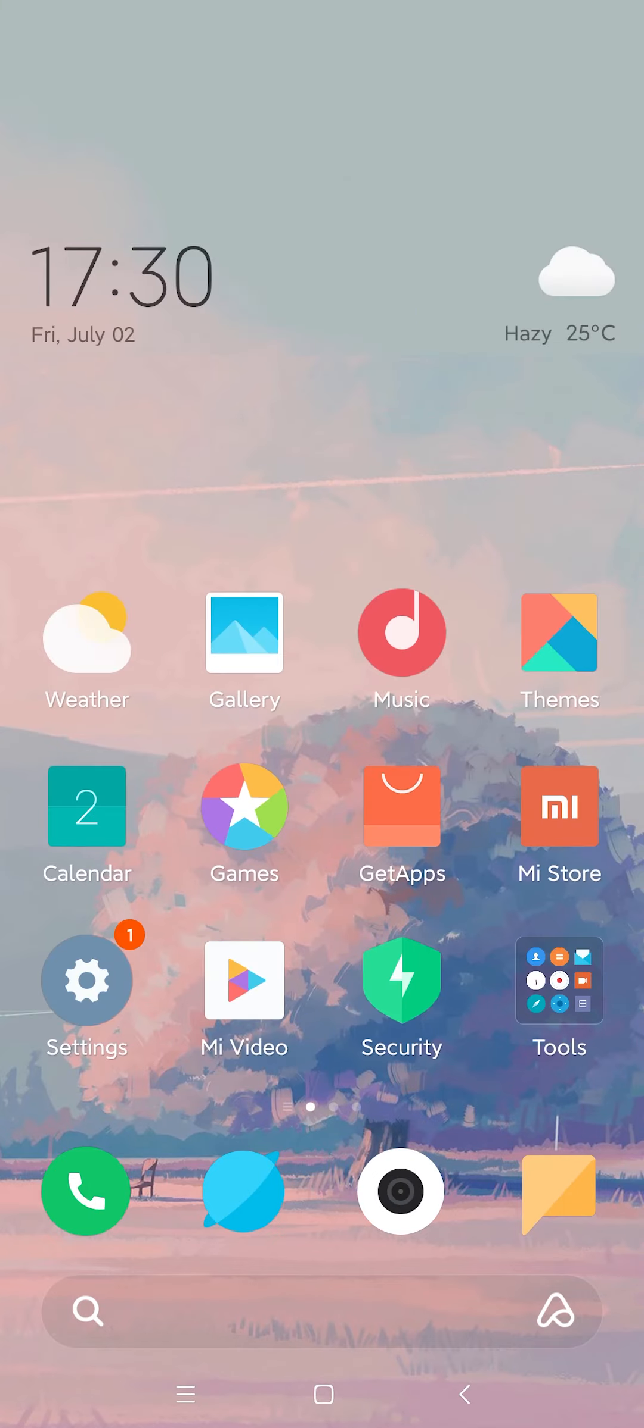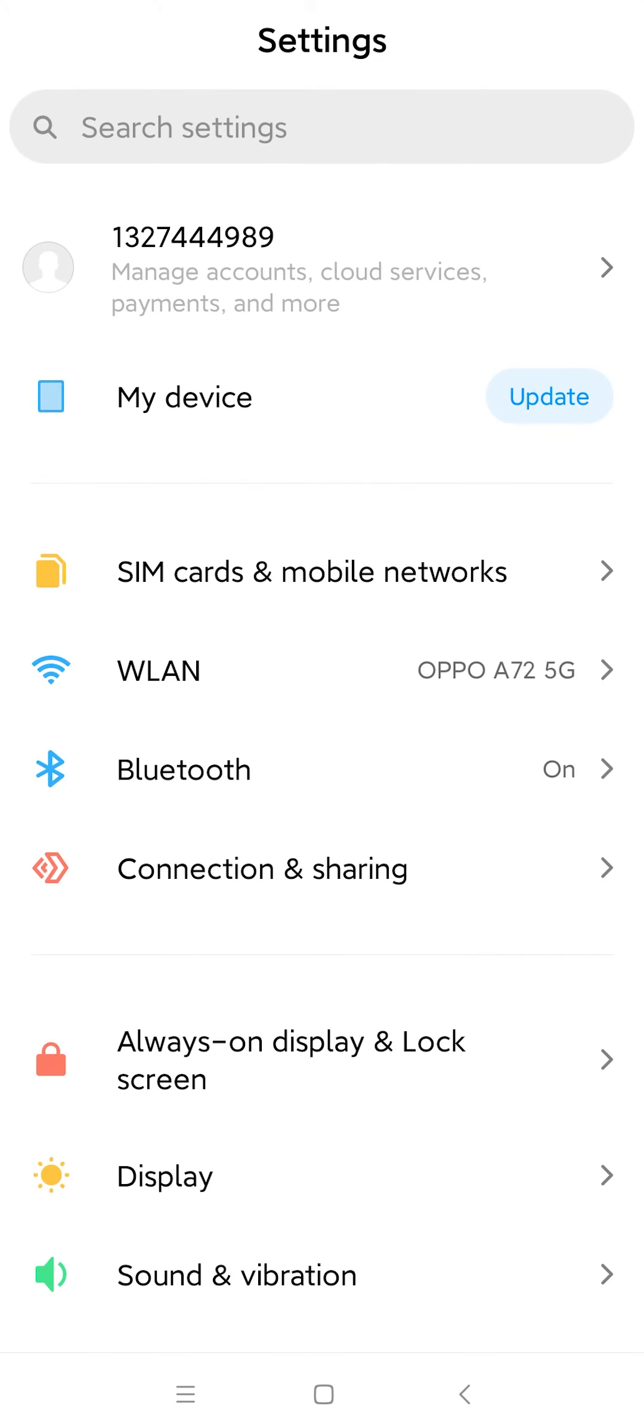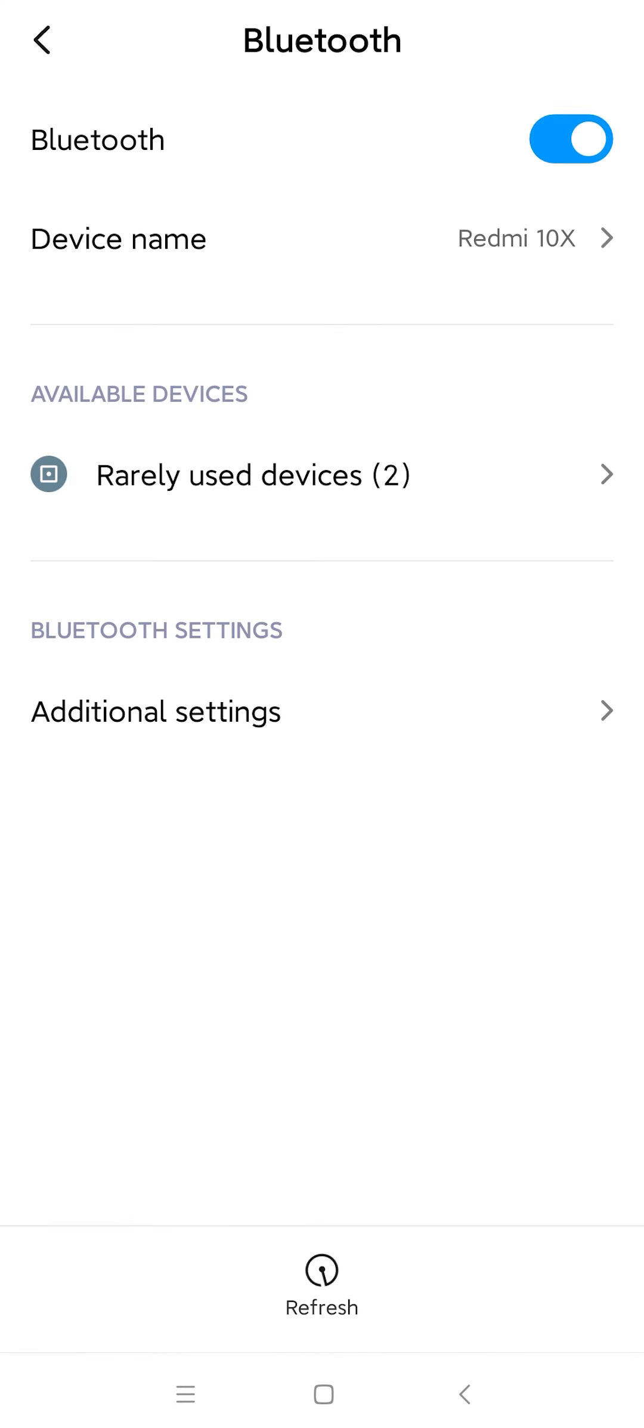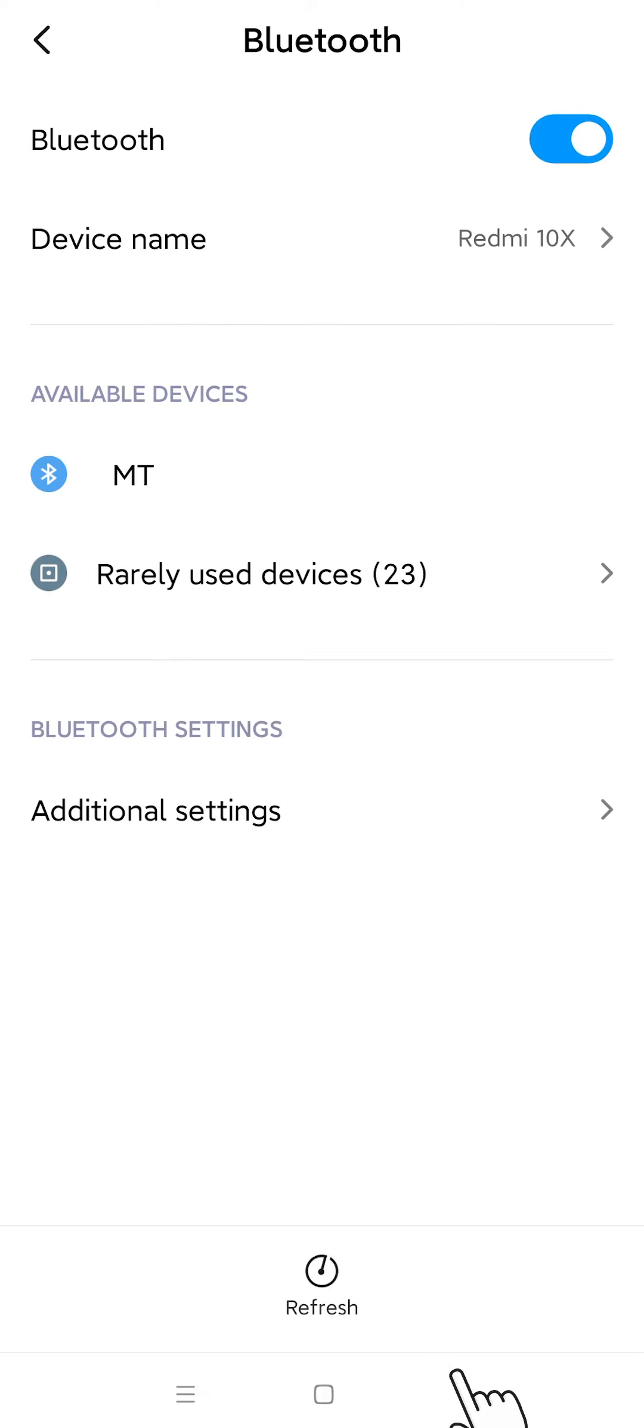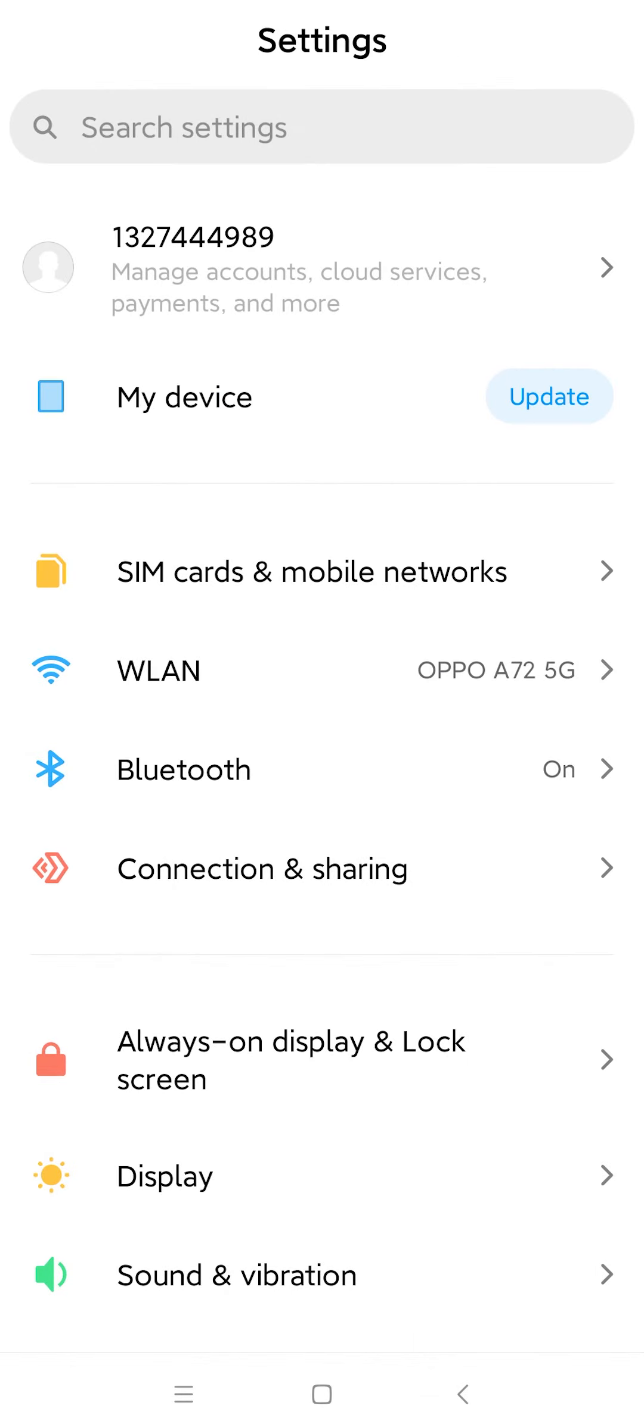Bring up the Settings page of your phone. Go to Bluetooth and make sure it is always turned on. Go back to the Settings page.